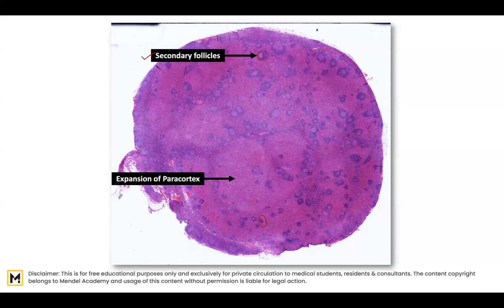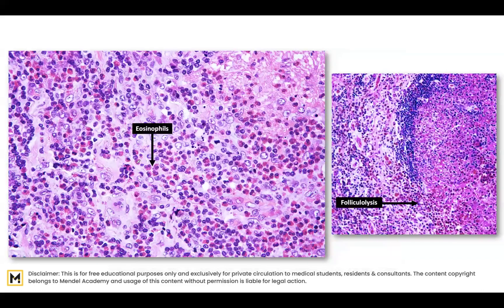The other feature is expansion of the paracortex. The paracortex is normally the home for T lymphocytes and represents the interfollicular area — the zone between two follicles. In Kimura disease, the paracortex is expanded and filled with eosinophils.